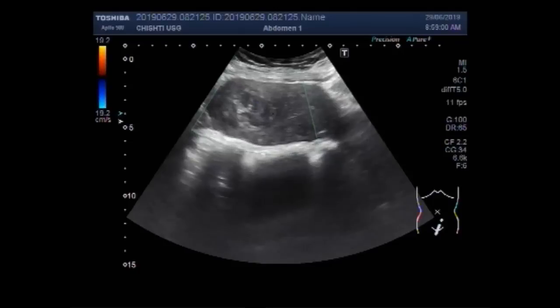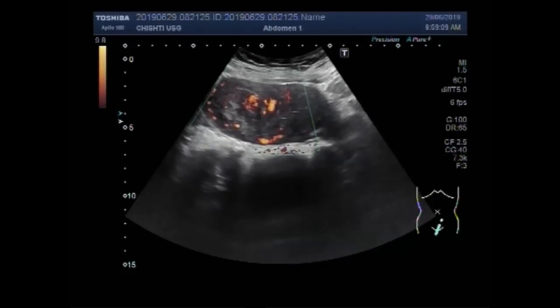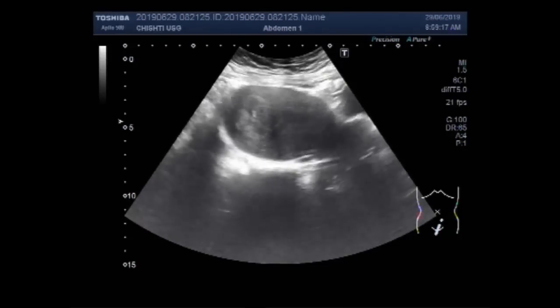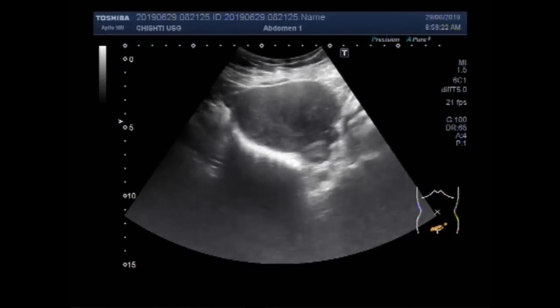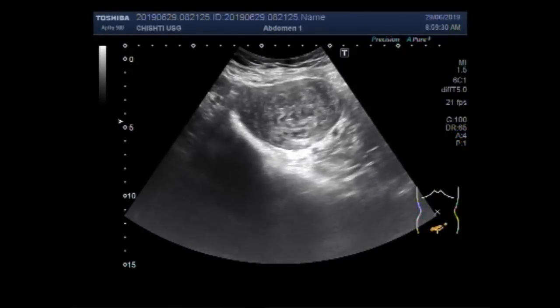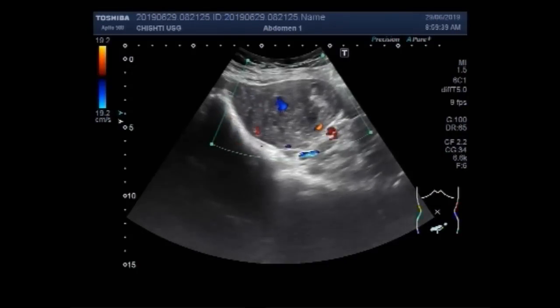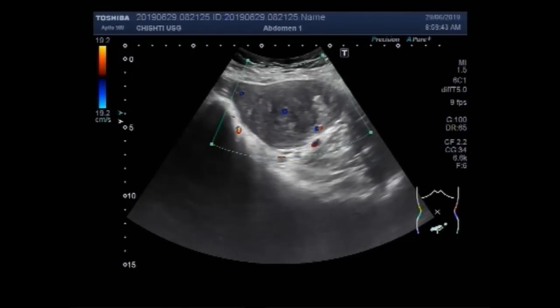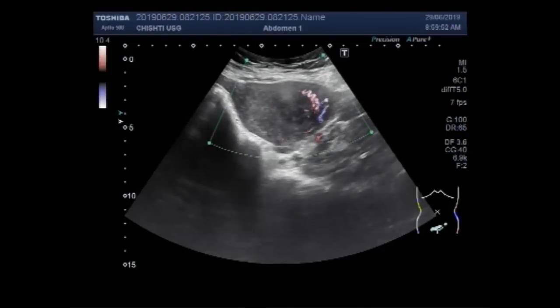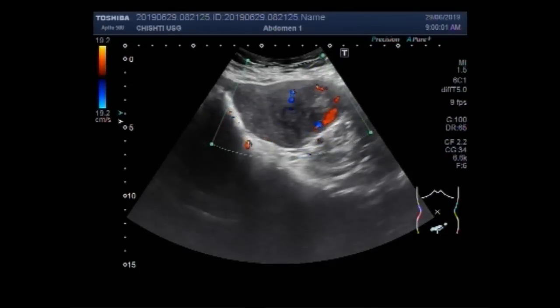You can see plenty of blood flow in its interior, especially in the rim region. Again you can see the blood flow in the mass. There is significant blood flow seen in the mass, which indicates that it may be a malignant mass.